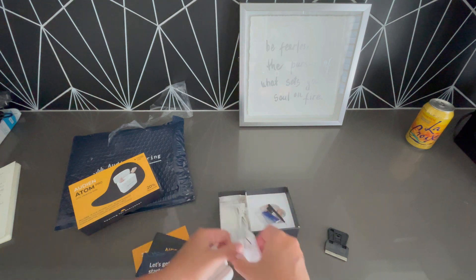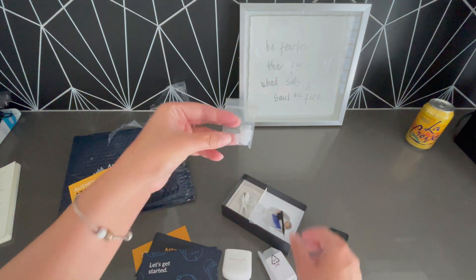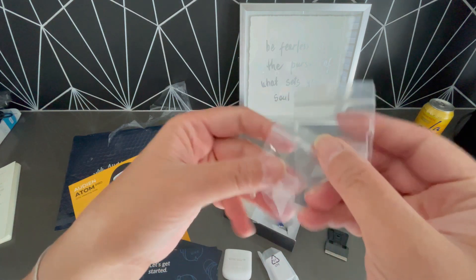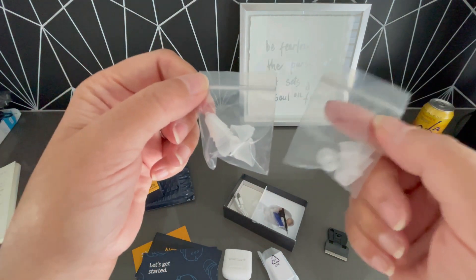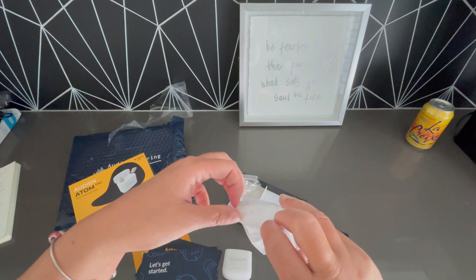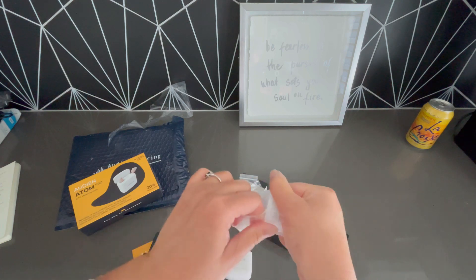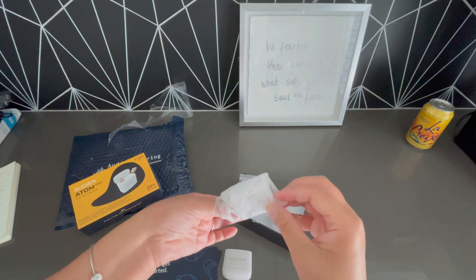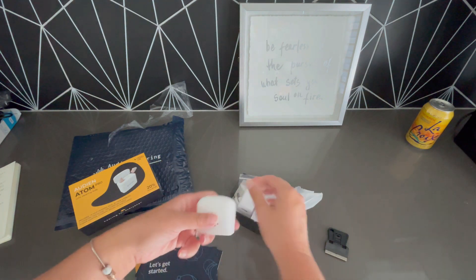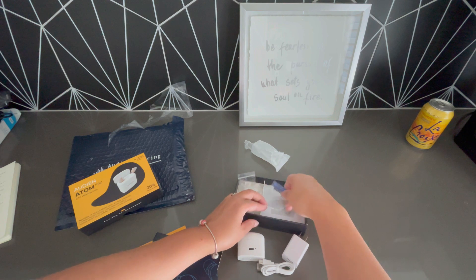And then finally, here's a little charging cord. Different sizes so that if you have a bigger or smaller ear, you can change — look at all of them. Making sure it fits. And here's the actual little unit that connects and allows you to plug it in — standard USB plug-in.